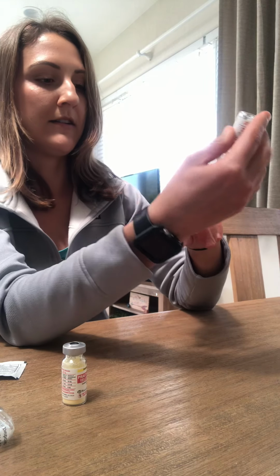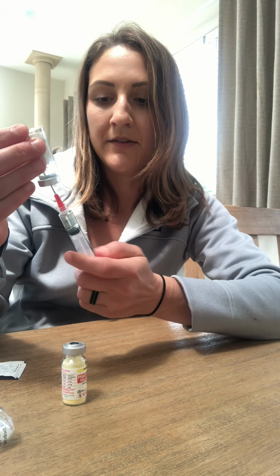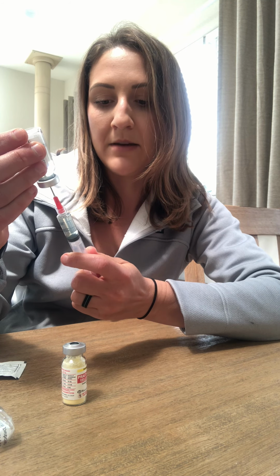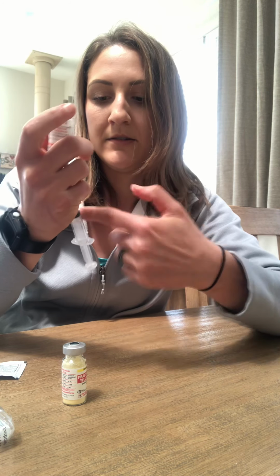I'm gonna invert it, allow the syringe to fill with diluent, 3 mLs. I'm going to expel any air bubbles.